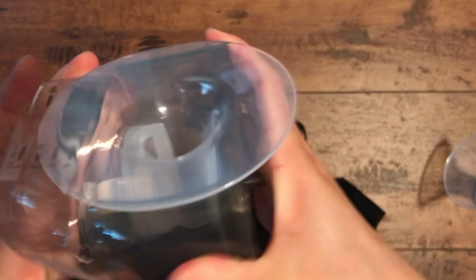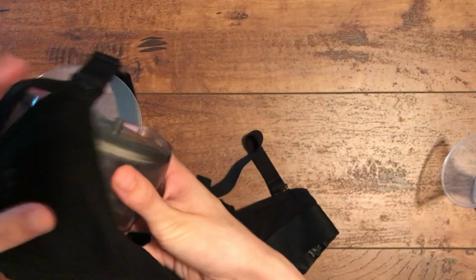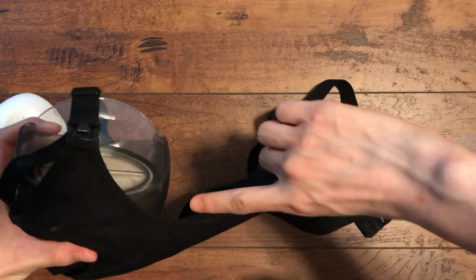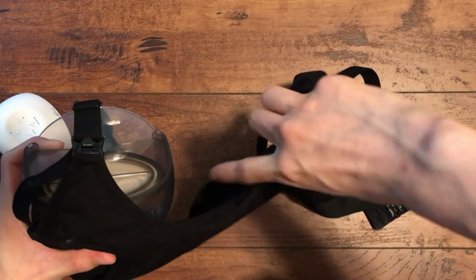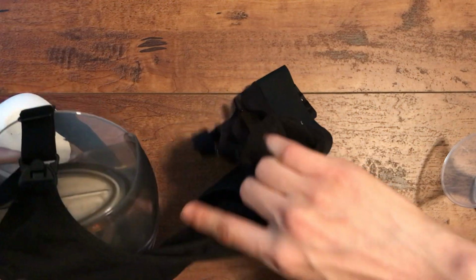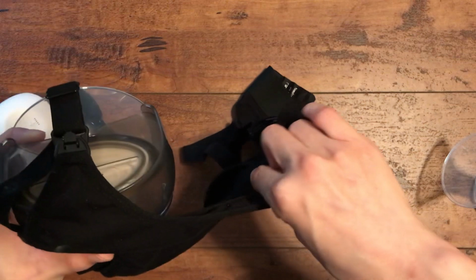See, this suction isn't that strong. It keeps coming off. So you can wear it, and then you can peek in through the middle part to see if there's any milk collection here. That's what I've been doing. I peek in during the pumping session.